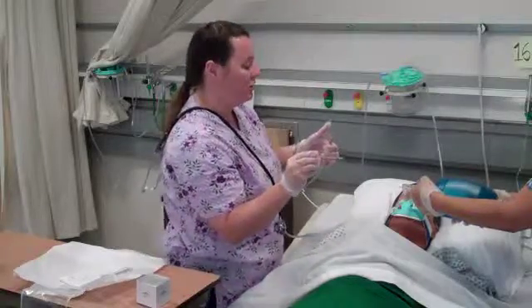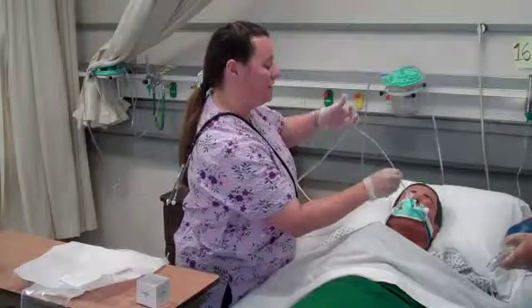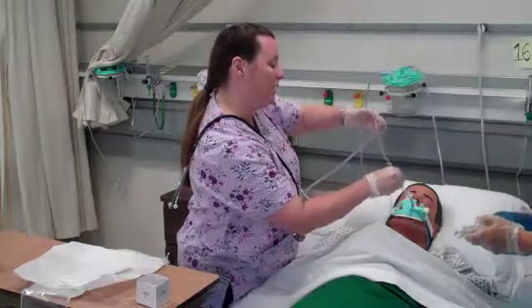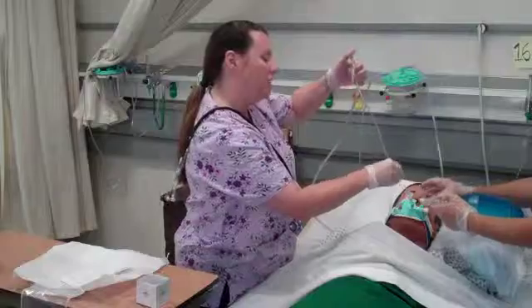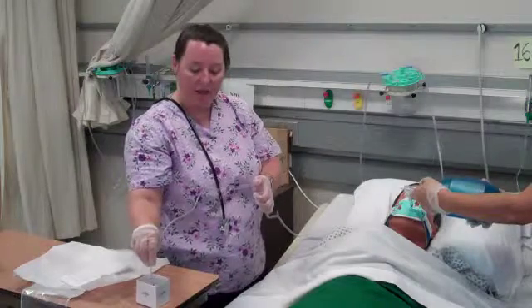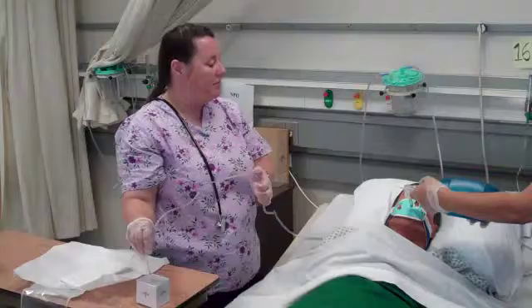Again, the patient is going to be removed from the oxygen source. I'm going to go down again, sterile technique, not touching that tube to my hands. I hit resistance, patient starts to cough, I pull up a centimeter and apply intermittent suction as I pull that tubing out. Twisting and twirling as I come out. I'm going to go ahead and clear my tubing again. Kathleen is applying supplemental oxygen, and I'm going to again reassess my patient.